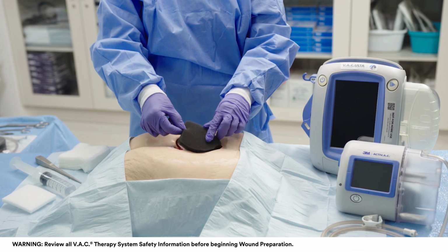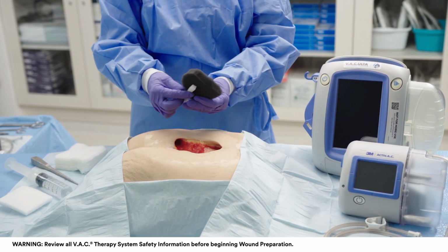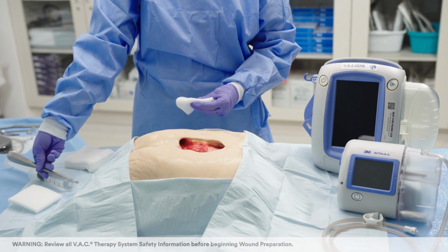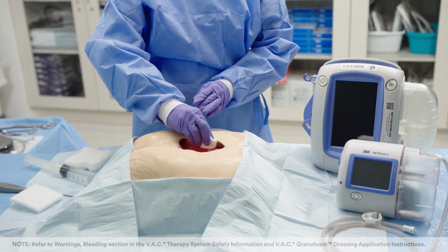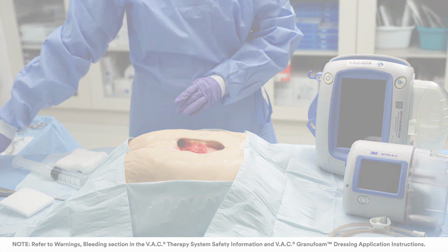Before applying a new dressing, remove and discard the previous dressing per institution protocol. Thoroughly inspect the wound to ensure all pieces of dressing components have been removed. Perform a thorough wound and para-wound area cleaning per physician order or institution protocol prior to each dressing application. Ensure adequate hemostasis has been achieved.